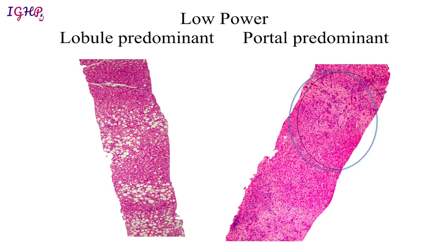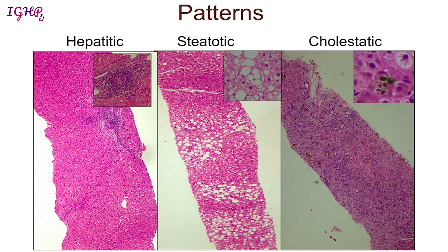Whenever we assess a liver biopsy slide we should first view it at low power, and we should be able to determine whether it is a lobule-predominant pathology or a portal-predominant pathology, or both. In a lobule-predominant pathology the portal tract remains relatively quiet and the major pathology lies within the lobule. In a portal-predominant pathology the problem lies predominantly within the portal tract, as seen in this case where there is marked expansion of the portal tract with less significant lobular changes.